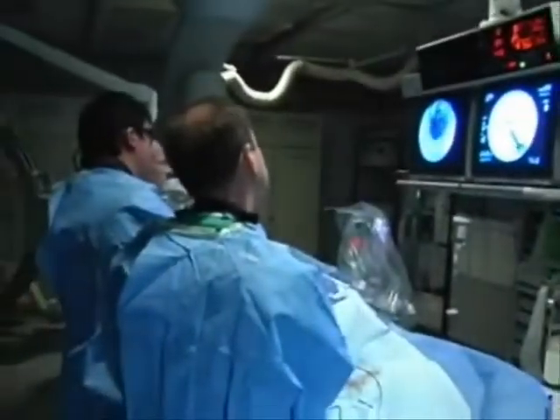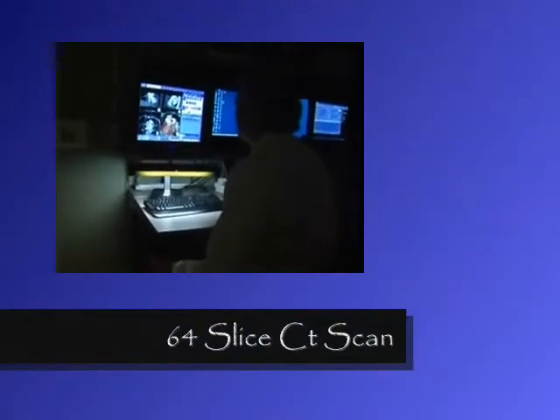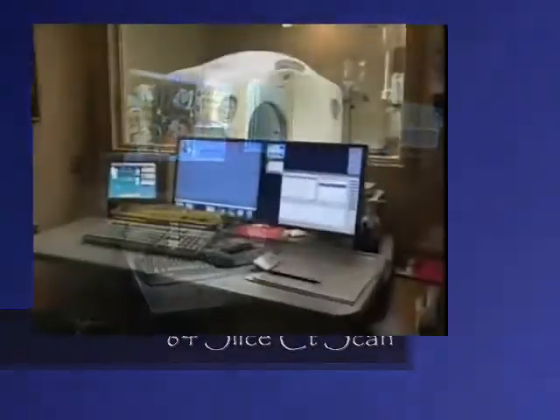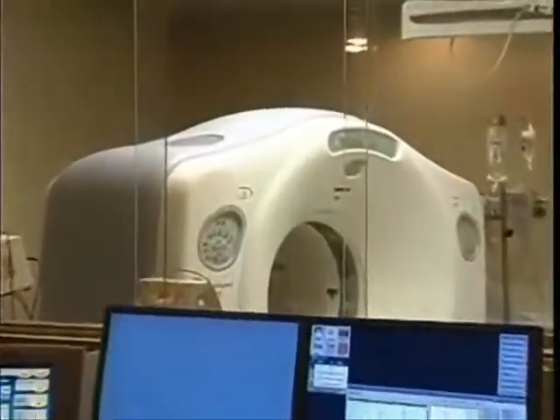This advanced imaging tool will help physicians diagnose and pinpoint heart attacks and strokes. Computed tomography has been around for years, and just a few years back, the gold standard in this technology was the 16-slice CT scanner. Now, the state-of-the-art multi-slice technology is the 64-slice CT scanner, and it's making a big difference for Ochsner physicians when it comes to taking pictures of the heart and arteries.